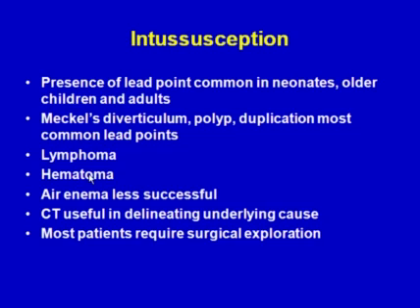In these particular patients where a lead point is suspected, a CT is often very useful in delineating the underlying cause, and these patients are generally going to require surgical exploration, because even if they are reduced, they will have a tendency to re-intussuscept. And obviously, if a lead point is identified at the time that they present, then it is incumbent upon their treating physician to surgically explore them and remove that lead point.